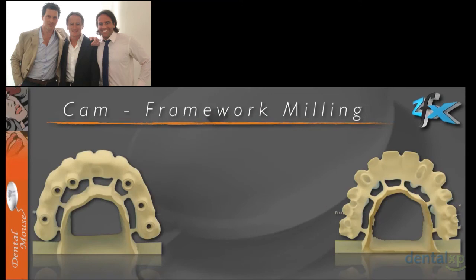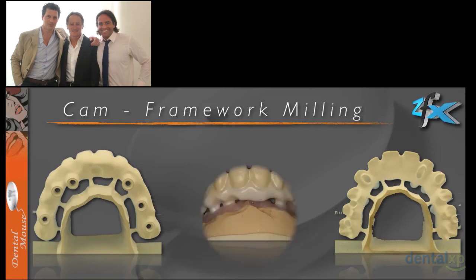So after we did everything on the CAD, we go to the milling center. We send everything to the milling center that is going to mill our project. We are going to use zirconia. In this case you see the project with the pre-sintered zirconia, and then you have your framework in full zirconia. From there we start the try-in in the mouth.